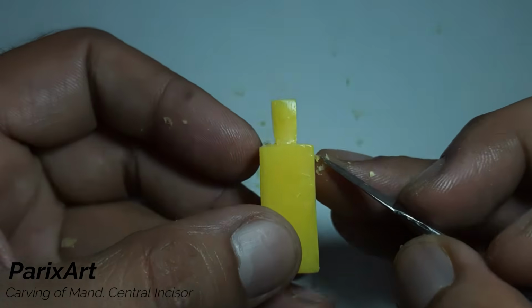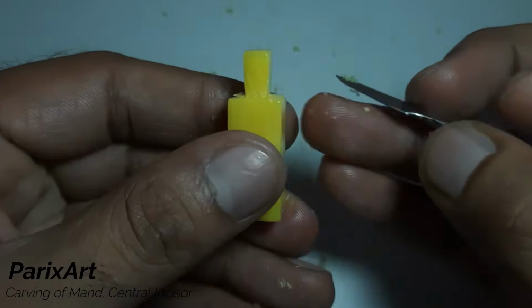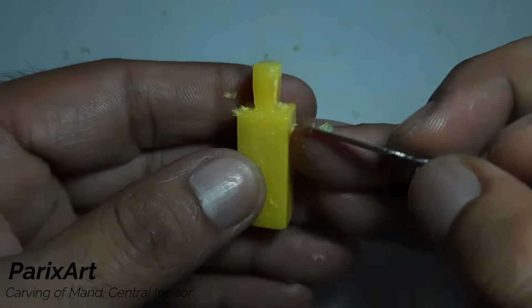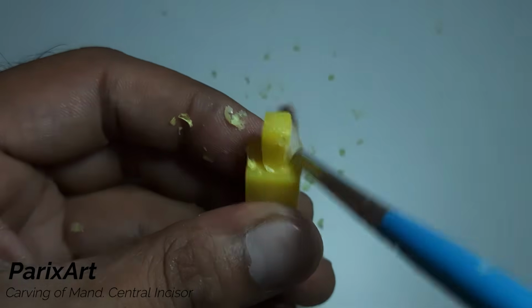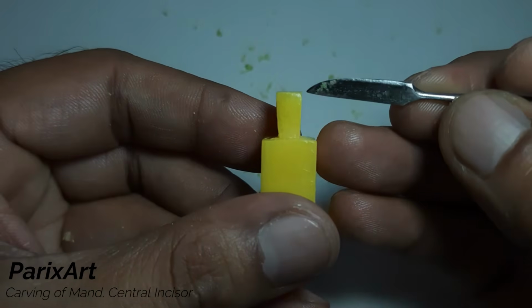See, we are achieving even taper now. Also remember, both incisal angles are sharp.